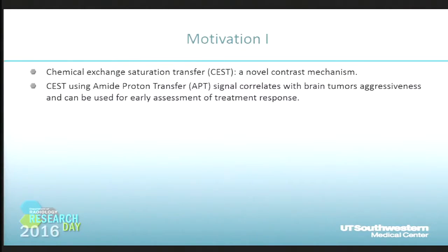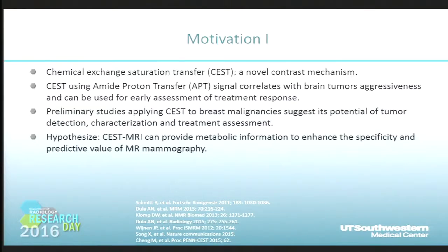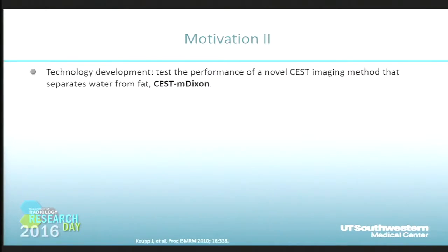These studies motivate researchers to explore CEST elsewhere, so recently, some preliminary studies applying CEST to breast malignancies have come out, and these suggest that CEST has potential for tumor detection, characterization, and treatment assessment. These preliminary studies captured our interest, and we hypothesize that CEST MRI can provide metabolic information to enhance the specificity and predictive value of MR mammography. The work presented today is our pilot study.